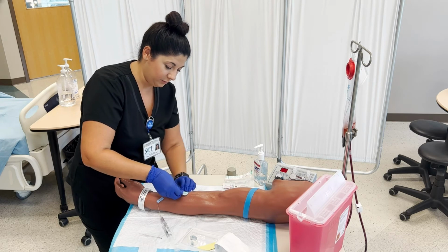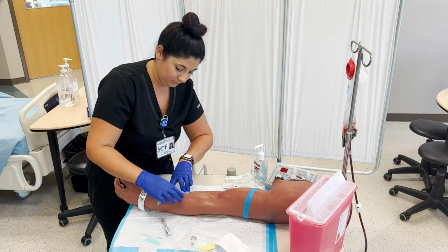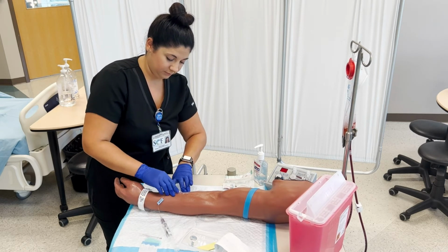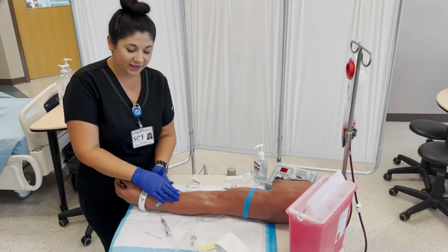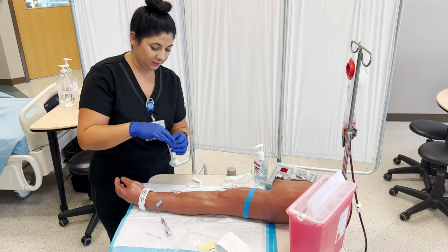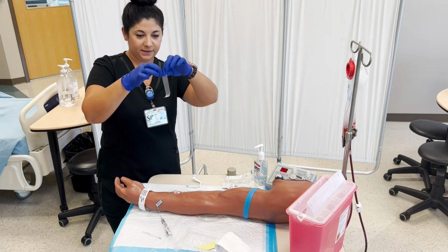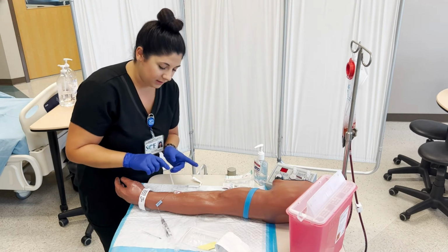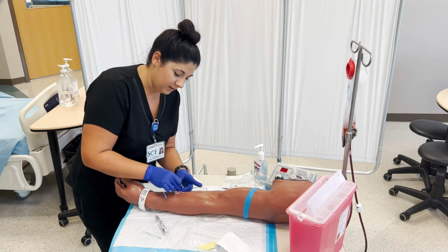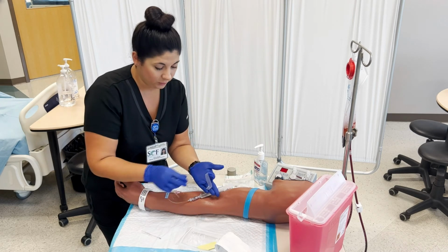Putting that tegaderm right over the site. Once you have your tegaderm on, I grab the tape, and you can do this part with or without your gloves. I like to rip this down so I have a small piece and use that to make a chevron. So you put the sticky side under and then cross it over. And then I'll use the bigger part to secure the tubing up here.